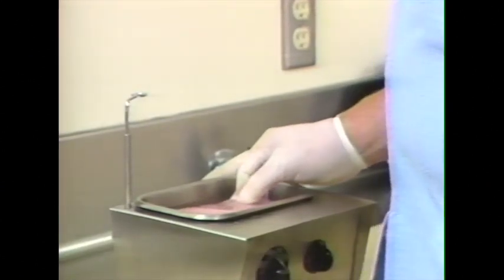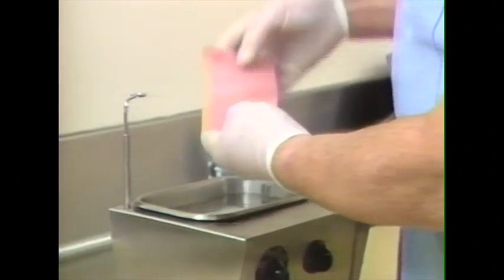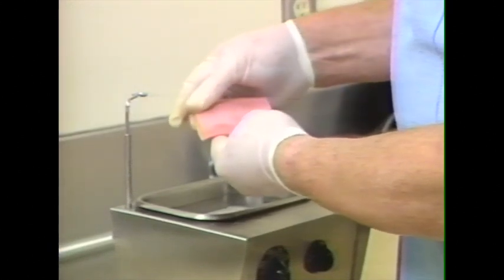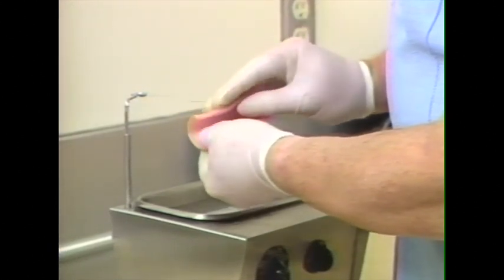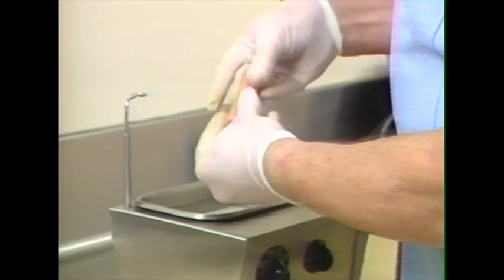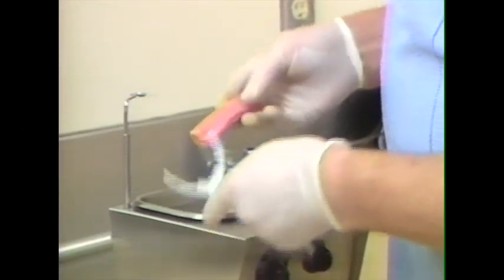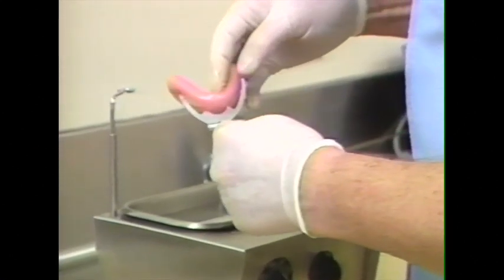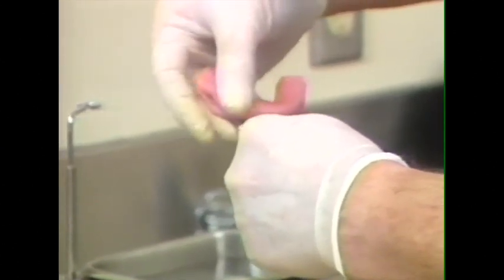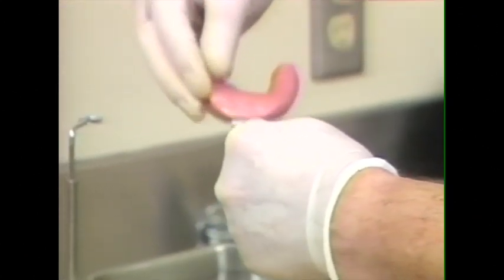So we have one piece of baseplate wax that we're heating in the compound heater here at 140 degrees, and we're going to fold this wax once, twice, and 3 times, and form a roll, then stretch it out slightly and attach it to the face bow fork, folding it over both sides of the fork so that there's an even layer of wax on each side of the fork.